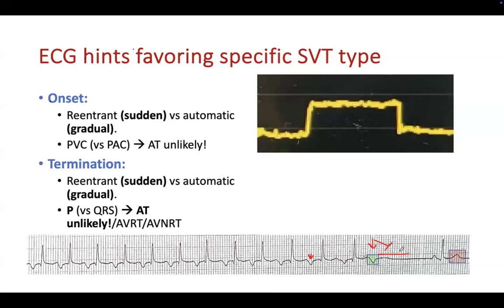If you have a patient with a long RP tachycardia like this case, and it terminates with a QRS, atrial tachycardia is a differential, of course. And if it terminates with a P wave, then atrial tachycardia is less likely, because it tells you that the AV node is part of the circuit, because whenever the AV node blocks, the tachycardia stops. Make sense? Well, I repeat this.